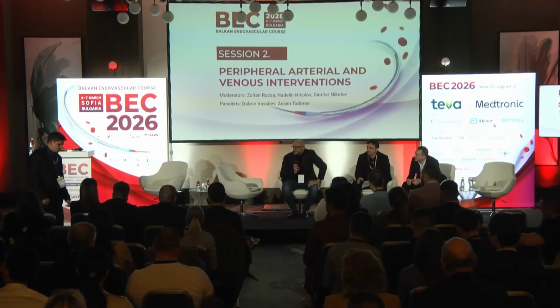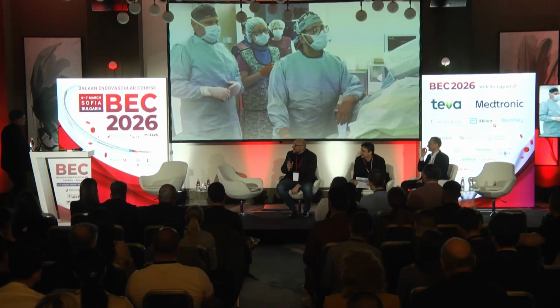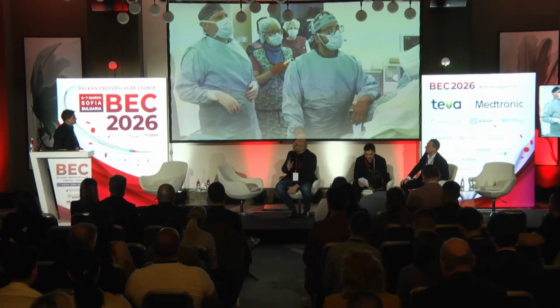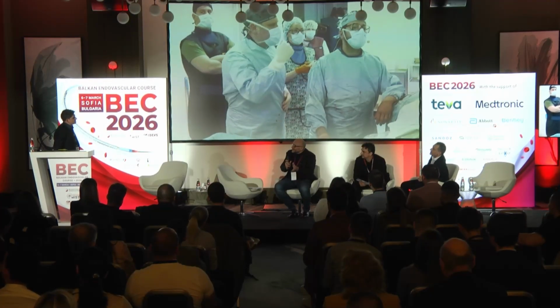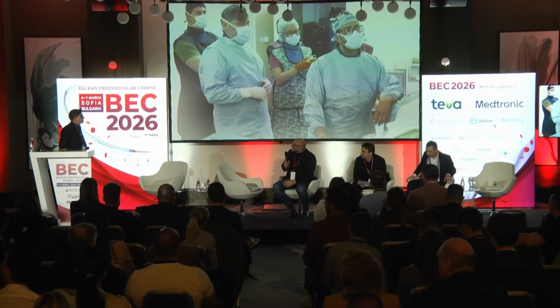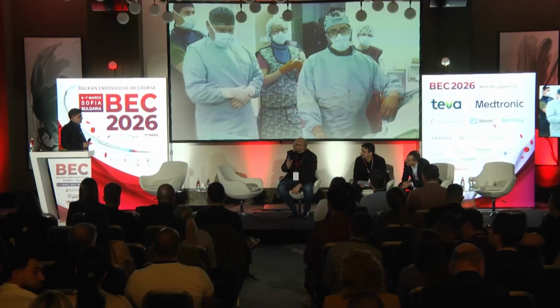Just one question to you, just for sport. It's a very interesting lecture, and congratulations, you started more than 10 years ago. Ten years ago you worked with the Wallstent. What has changed with the Wallstent? But now it is 2026, which stents do you use for iliacs and which stents do you use for vena cava?